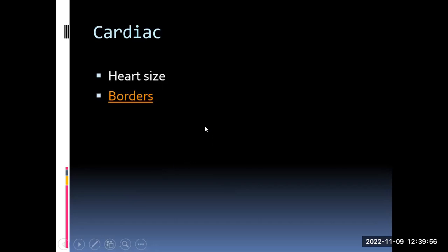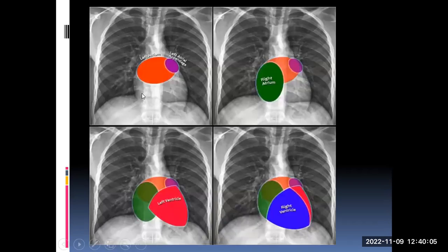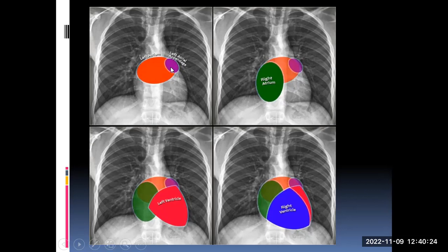Then you have to look at the heart. When looking at the heart, everybody knows how to check for cardiomegaly. You also have to look at the borders and the shape of the heart. Just remember: the left atrium is the most posterior and superior chamber. It has an oval-shaped chamber with a little appendage that bends forward. When the left atrium enlarges — both the main chamber and the appendage — the appendage forms the upper part of the left heart border. So if it enlarges, as in mitral stenosis, you will see straightening of the left heart border or a bulge, and the carina will widen as well.